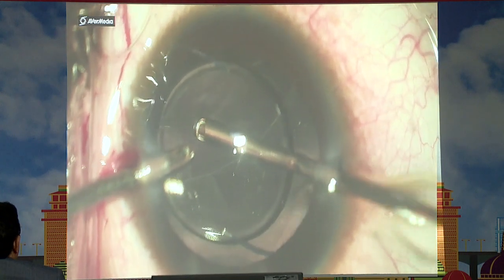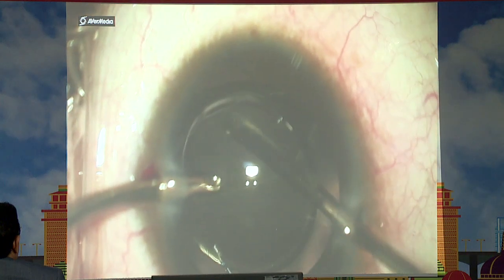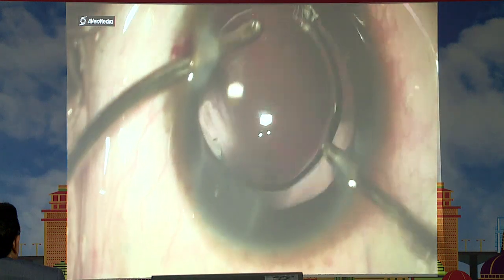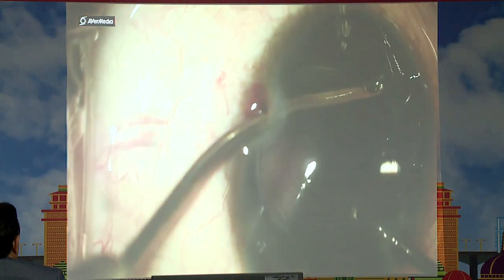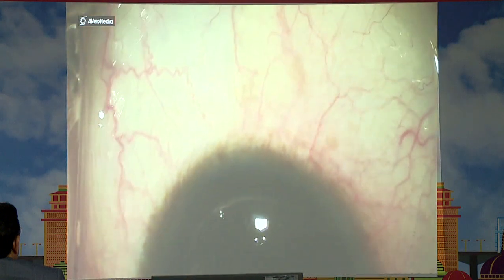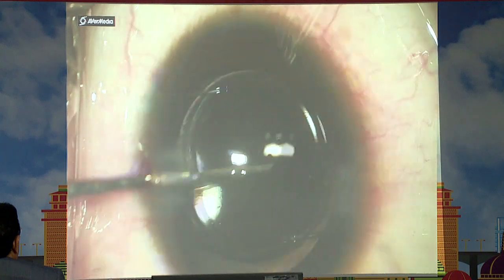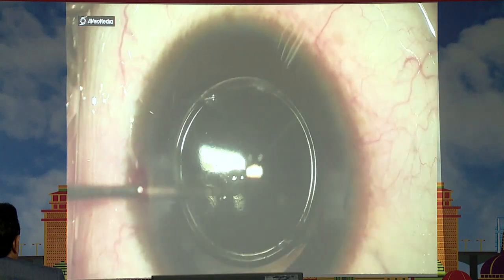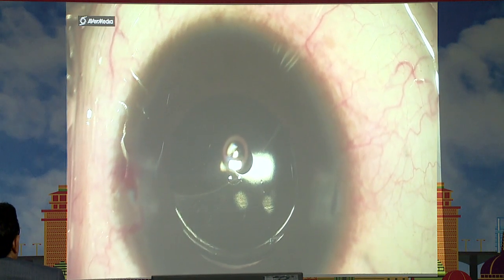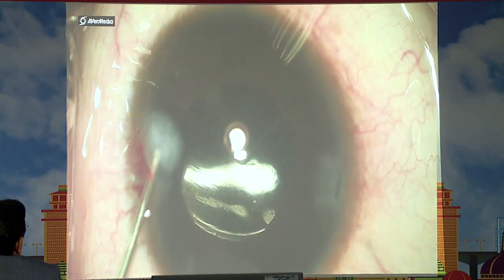and it's a very high speed cut rate. So if you see here, you cannot see the plunger moving itself. Once it is done, then the IOL will very comfortably dial and be placed in the sulcus. And then pilocarpine ensures that there is no vitreous, and another thing we can use is triamcinolone.